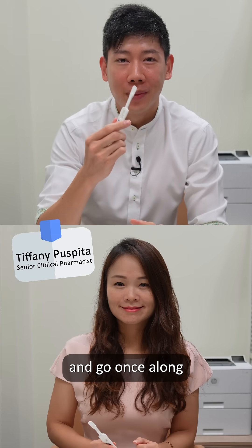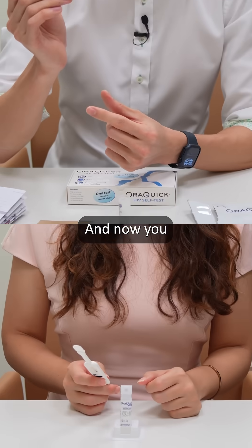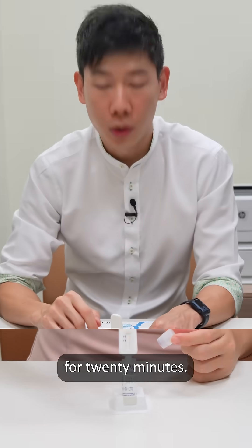Take the swab and go once along the upper gum like this, and once along the lower gum like this. Now you take the swab and put it in the test kit, and wait for 20 minutes.